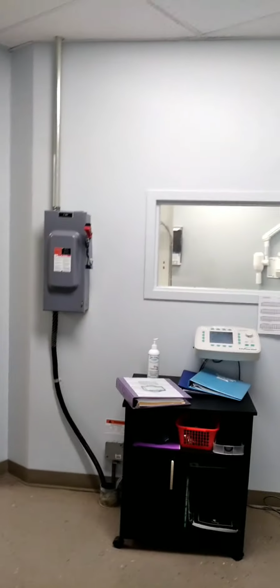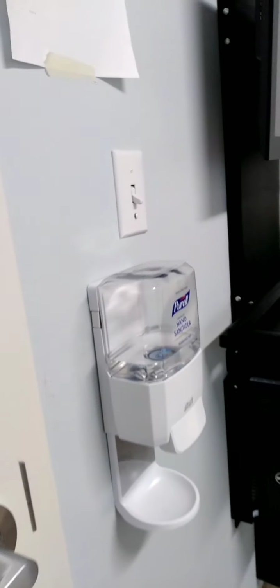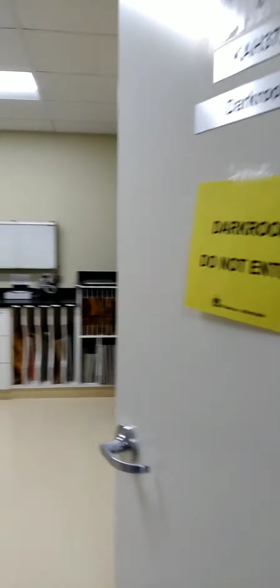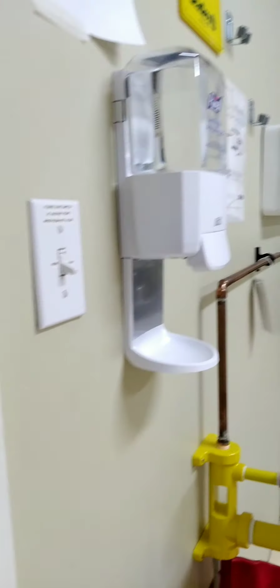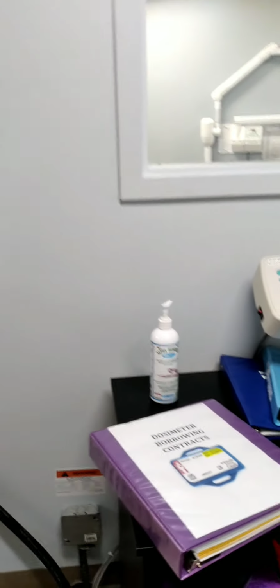So when you first enter the room, you are going to be asked to sanitize your hands. There is a wall sanitizer right beside the door. There's also one when you step into KH 37A, which is our dark room, right beside the door. And there are multiple bottles, kind of like this one, stationed throughout the room.